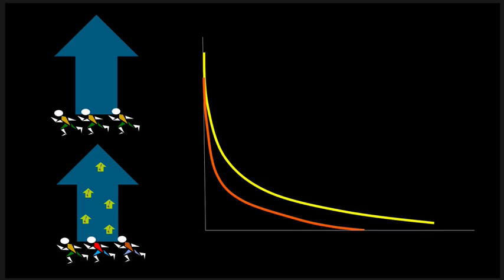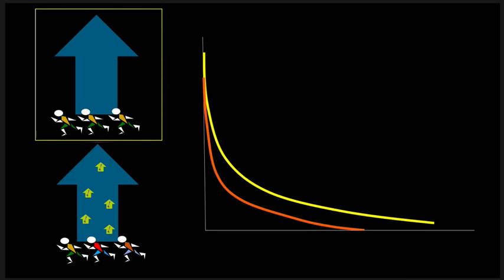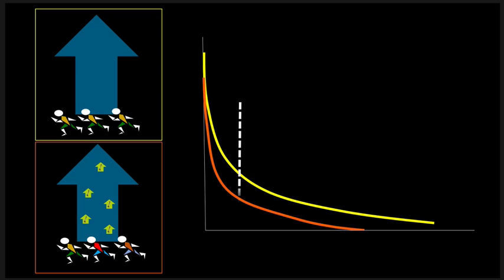So if we look at our diagram here, the homogeneous ones are going to be like the yellow here, like the regular T2, and the heterogeneous stuff that's got augmentation focally, different little tiny spots, is going to be the orange. And the more heterogeneous it would be, the stronger that T2 star effect would be.